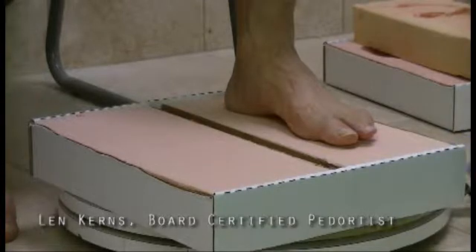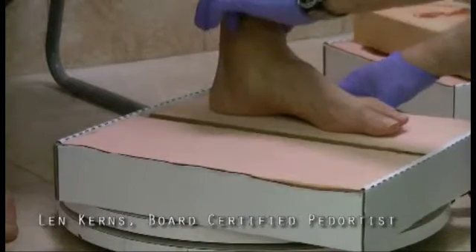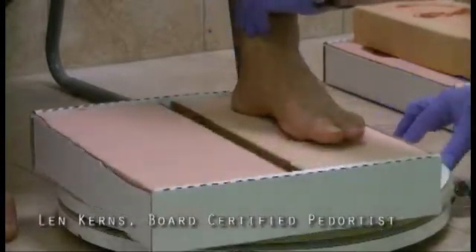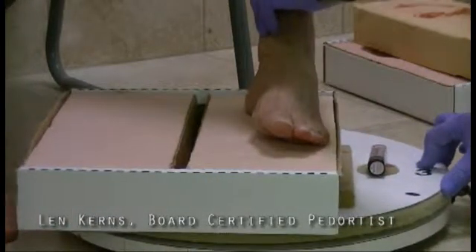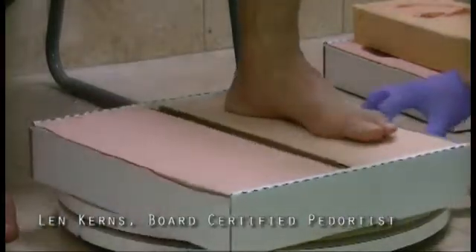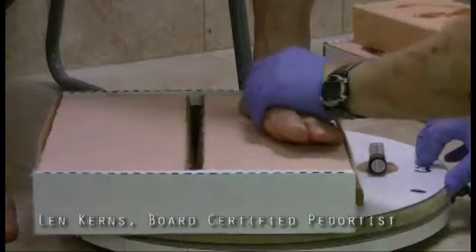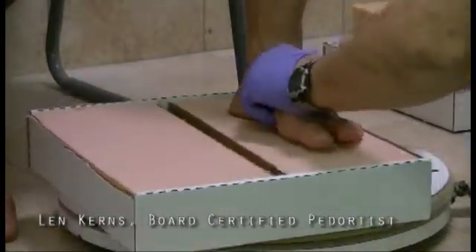And I am going to release the lock. And if I turn this counterclockwise, his arch is falling down. And if I just turn it clockwise, keeping a little pressure on the foam, you see you can supinate the foot. So right now the foot is supinated, it's pronated, it's supinating again. Of course it's sliding because I'm just trying to show you, keeping my hand out of the way.